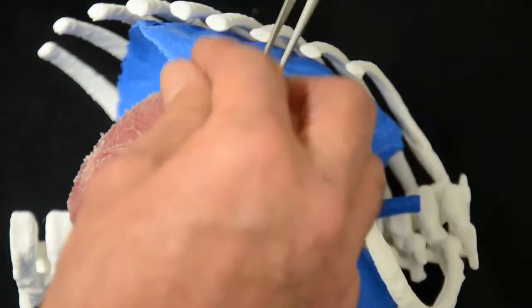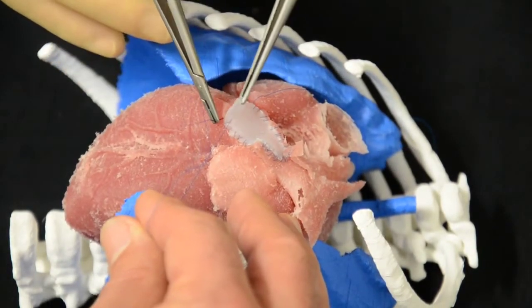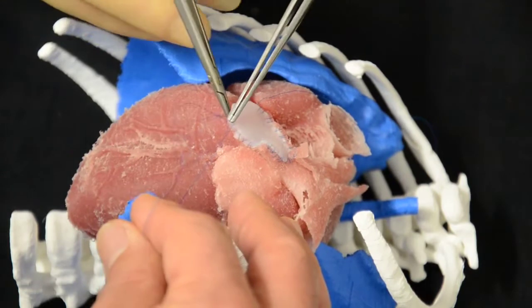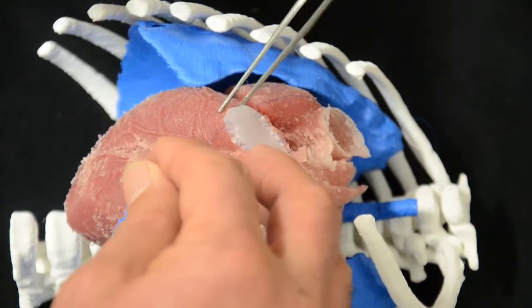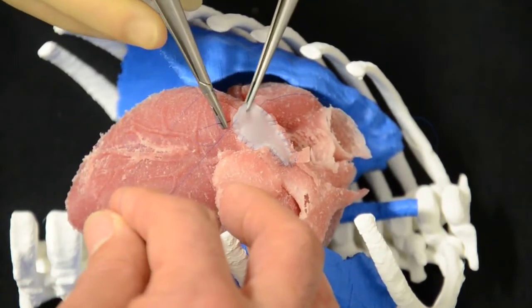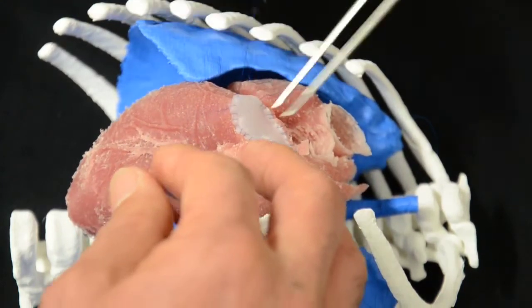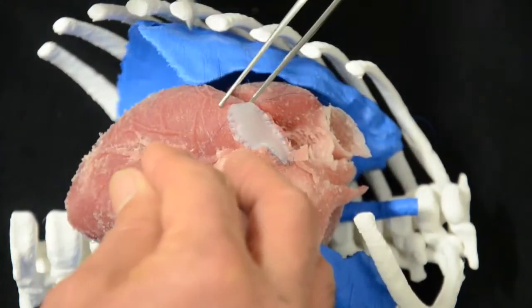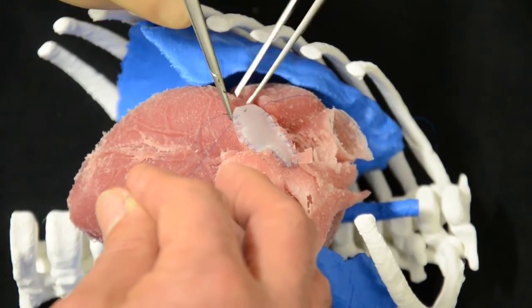If we imagine that this can be done as a training exercise every day, then when it comes to the real operation, Mr. Pelella will be very proficient straight away. He already is, but in future the idea will be to print patient-specific models — so if you print specific patients, you can do the operation beforehand and plan the size of the patch you need to use. It's a kind of personalized medicine, in a way.